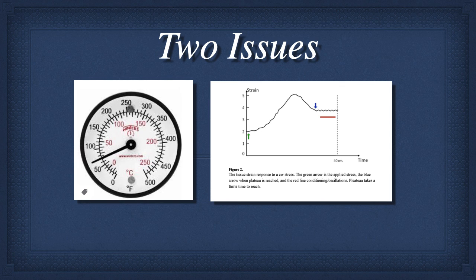So when we calculated in that paper the force of an ultrasound beam, it was like 2 orders of magnitude too high by our assessment to get accurate measurements. But with OCT, even we needed to apply less pressure than we were applying.